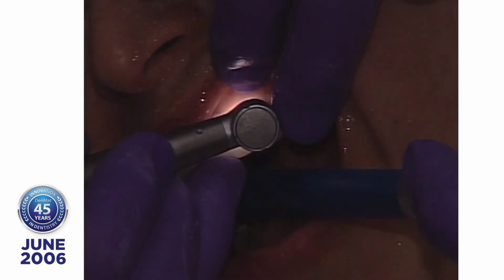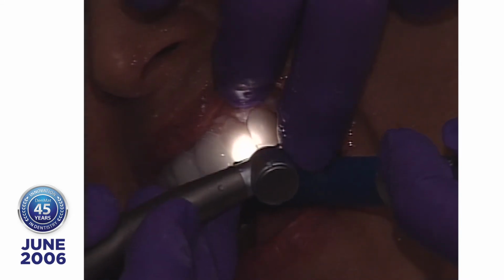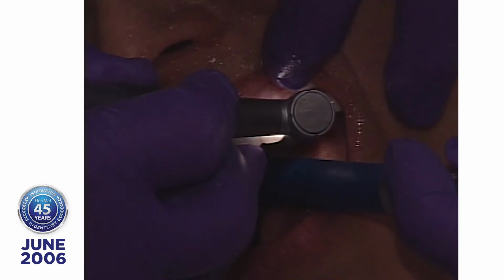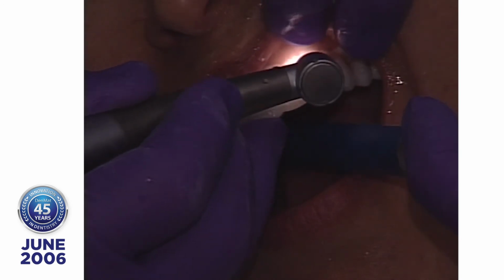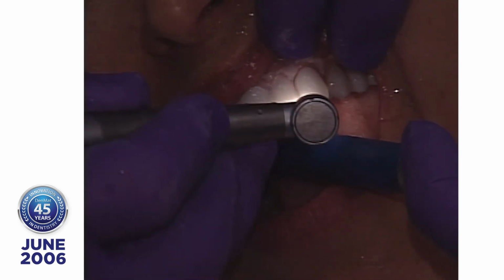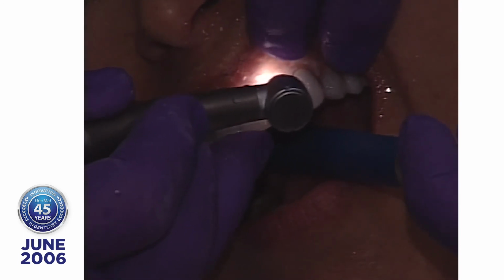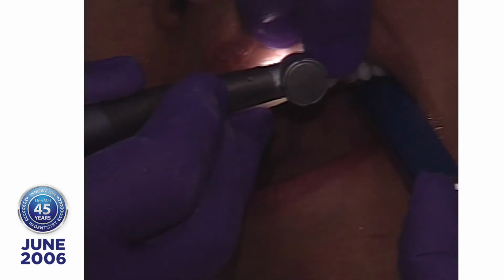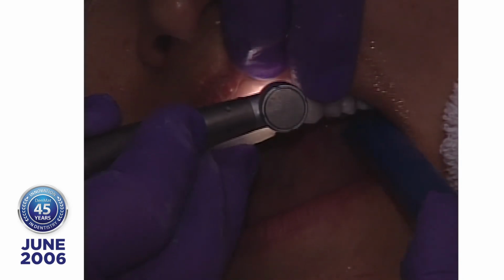And the reason is that I don't want to use porcelain remover. I don't want to use a porcelain diamond, because when I do that, I wouldn't be able to distinguish between cutting on porcelain or Ultrabond tactilely. And this way, when I come back in to remove the shoulders and blend things, I know I'm only going to be working on porcelain.